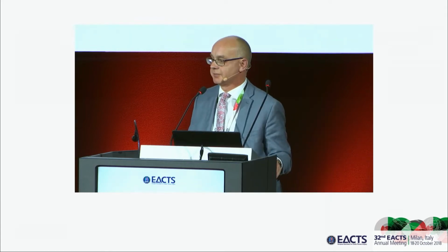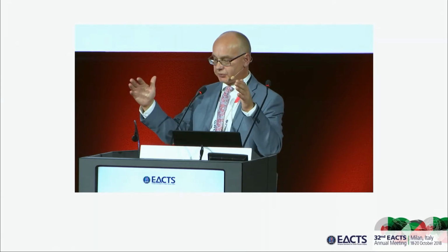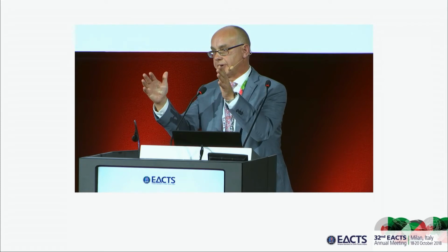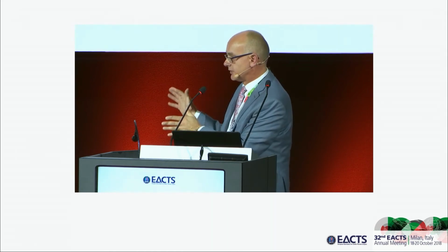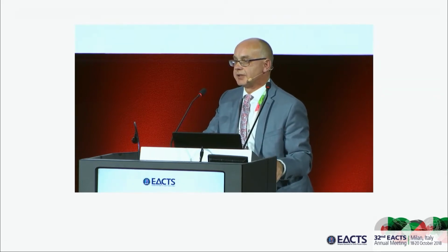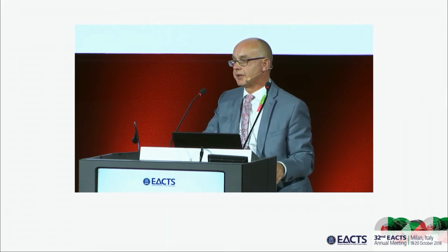The sizing is the same, and basically one needs to realize that in between the ring and the inner diameter of the aorta, of the annulus, is aortic tissue. So it's always the diameter of the prosthesis or the diameter of the ring minus 5. So when you have, let's say, a ring which is 28 millimeters, you will end up with a diameter of the annulus like 23, 22. And for sizing, we rely on one single measurement of the aortic annulus. So let's say if you have an aortic annulus 28, 29, I choose a Valsalva graft of 28, and for the ring, I always downsize by one size, so I would put 27.